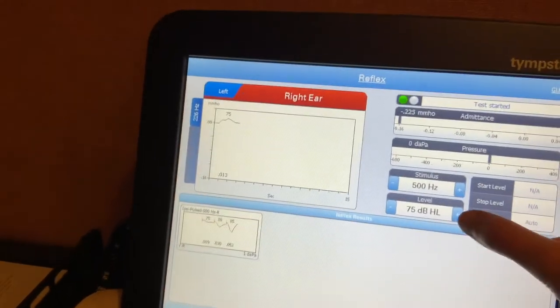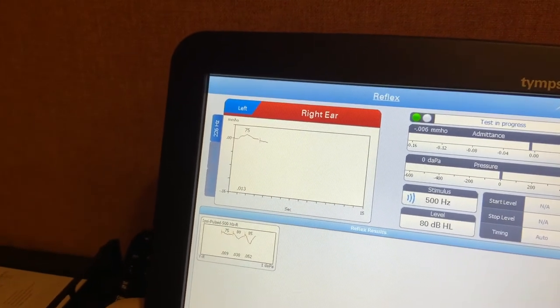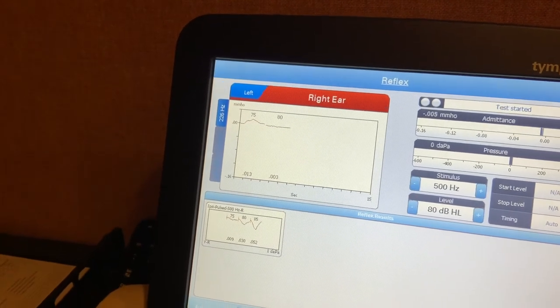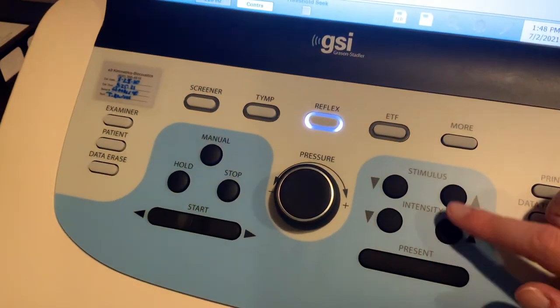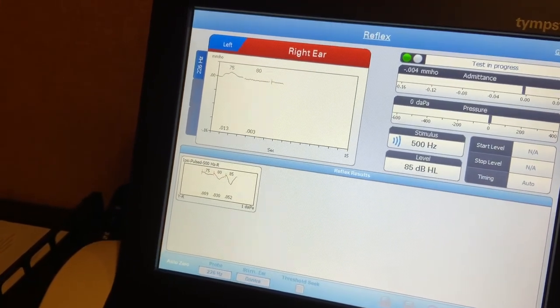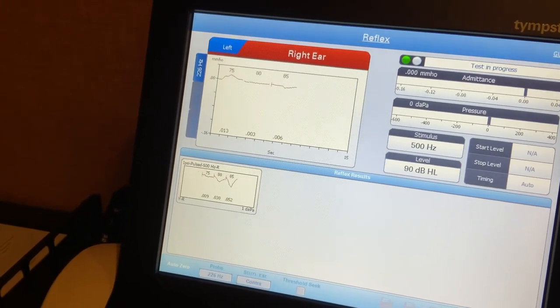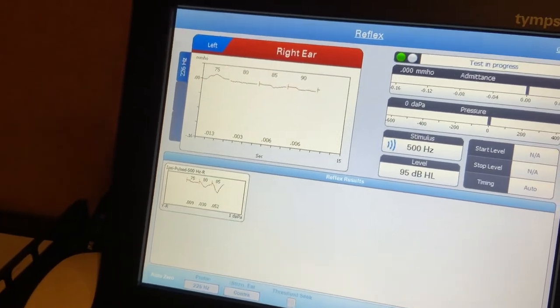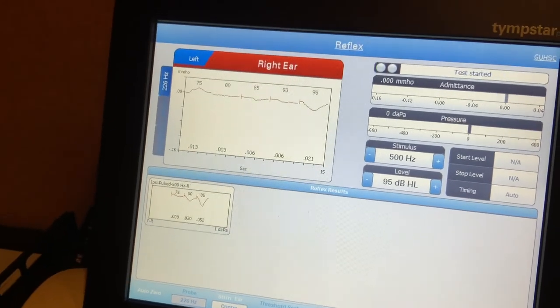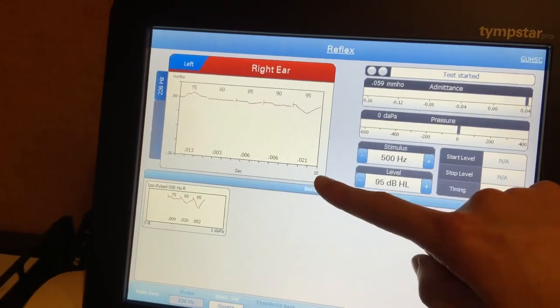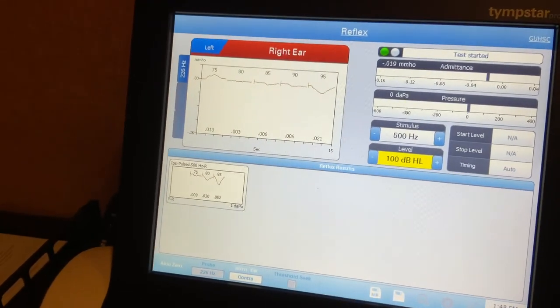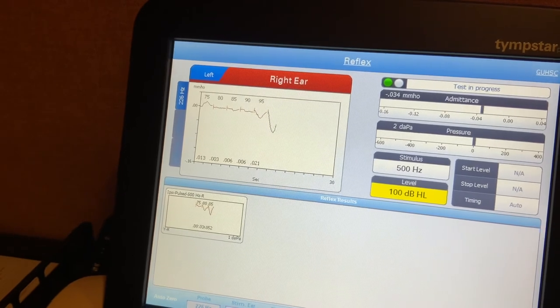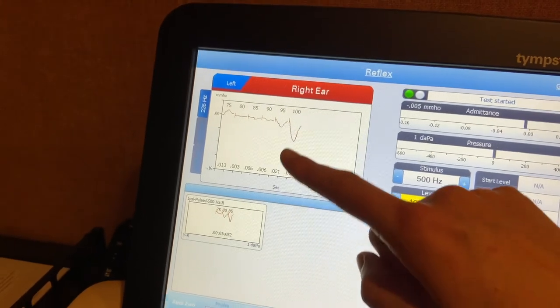As you can see, that is not a response. So we're going to go again. No response there. You can also increase the levels down here using the intensity and the stimulus settings. As you can see, Sarah has a response at 95 dB HL at 0.021. So we're going to again look for the growth pattern. So we're going to test at 100. And there you see the growth. So Sarah's response level is at 95.